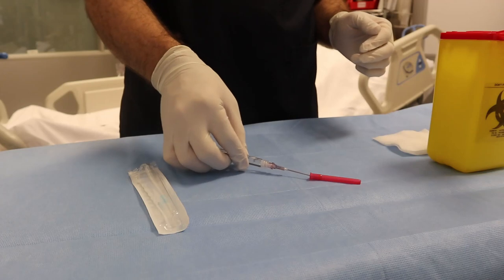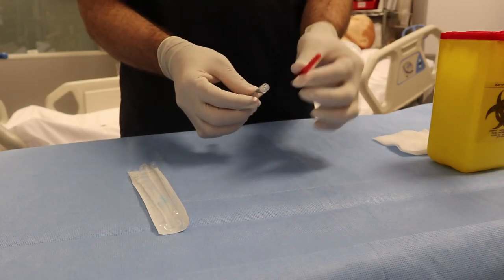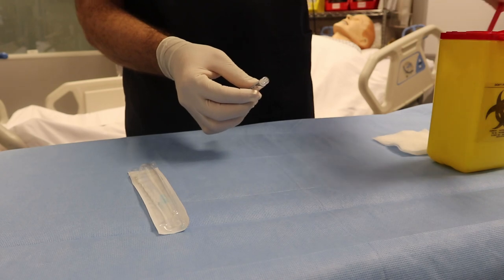If you then use the same filter needle to put the medication into a bottle, you would just push those accumulated glass particles back in. So the key message is: use the filter needle one time only. The recommendation is to use it when you aspirate from the ampule.